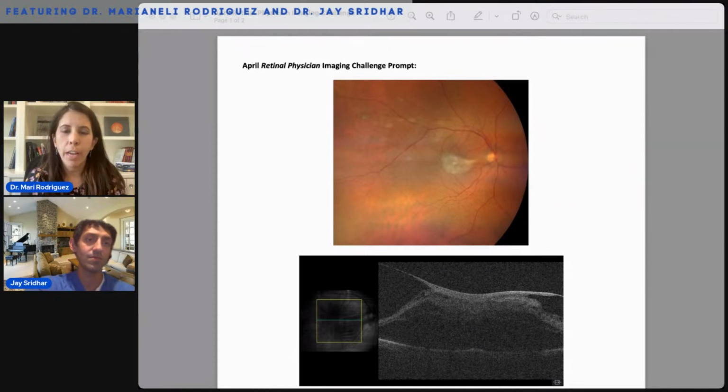How much do you shave when you're doing a case like this? Do you do a shave at all? So I've evolved a little bit. There's some literature from Japan where they don't even do a vitrectomy. They go in with 27 gauge instruments, peel the ERM, take it out of the eye and come out. And those patients seem to have good outcomes when they publish it.